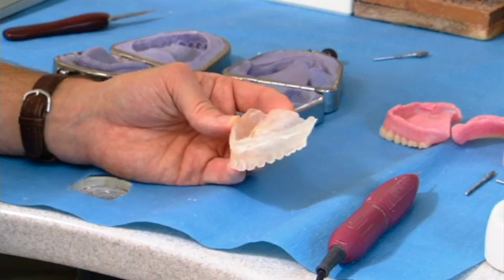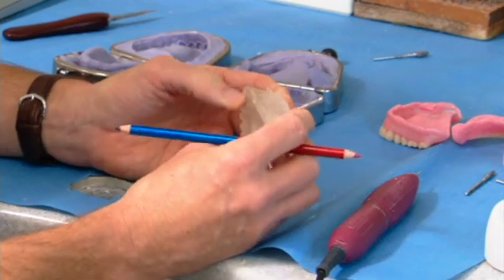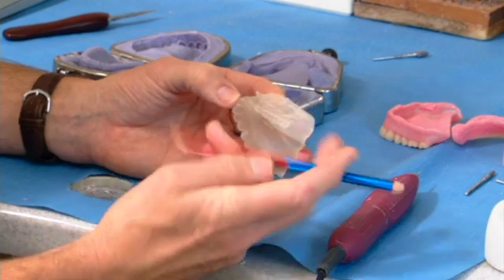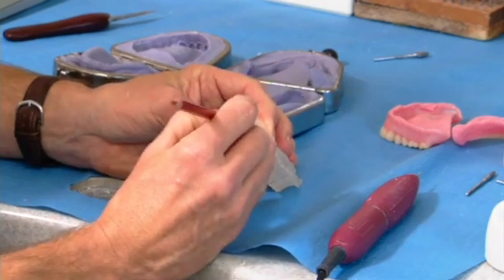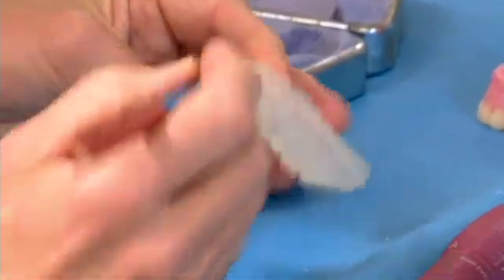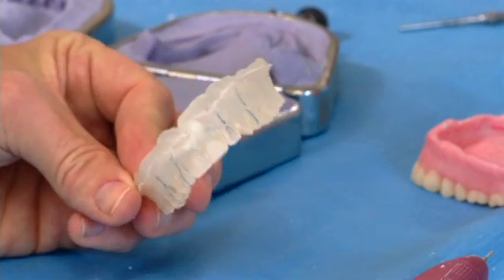The other nice thing about this is if we want to use this as a positioner for implants, if we want to put an implant in the position of number 12 and number 5 and number 10 and number 7, we can drill a hole, and if we're referring this to a periodontist or oral surgeon to place these implants, they can use this as a jig or an implant positioning guide.